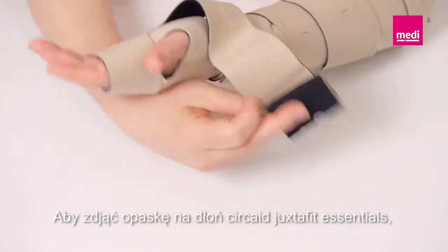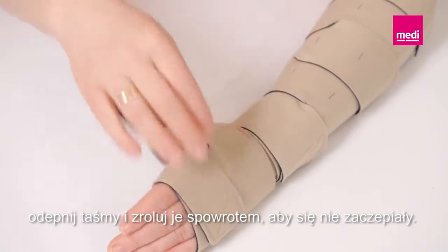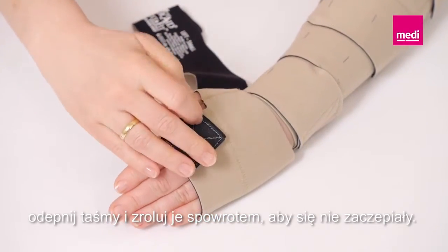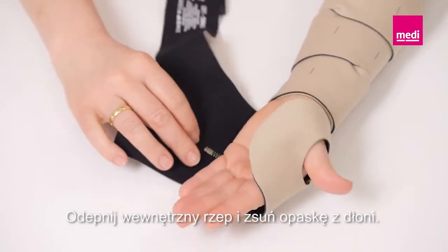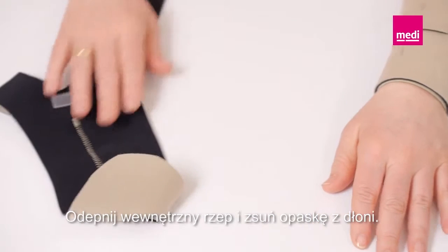To remove the Circade Juxtafit Essentials hand wrap, detach the bands and fold them back onto themselves to keep them lint-free. Detach the inner Velcro tab and slide the wrap off the hand.